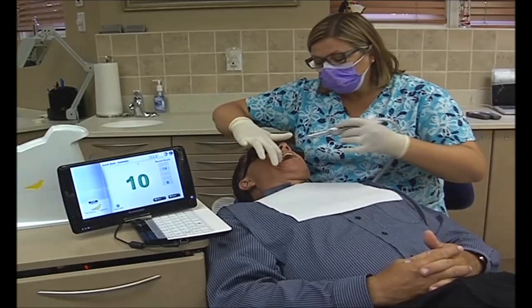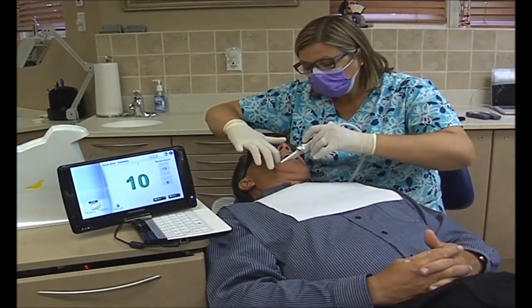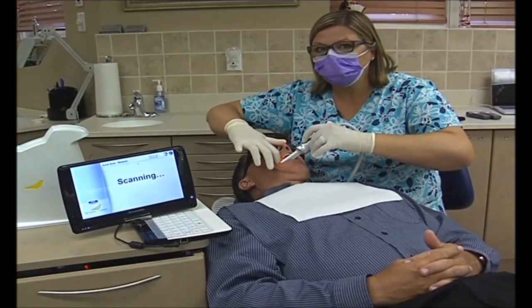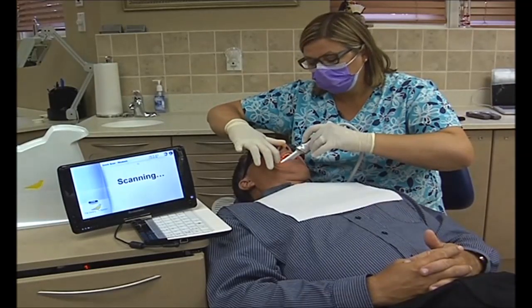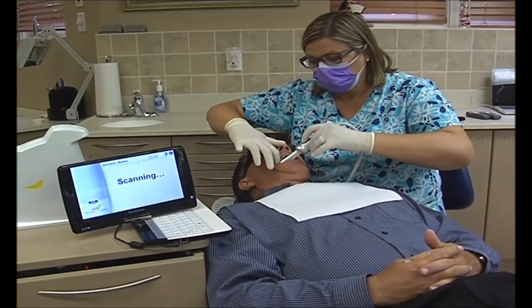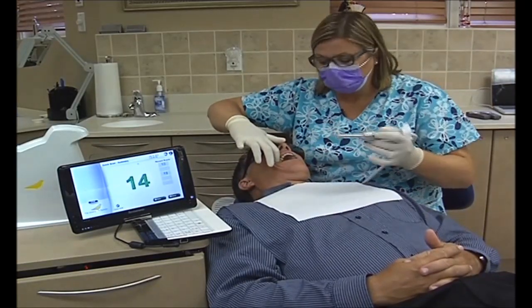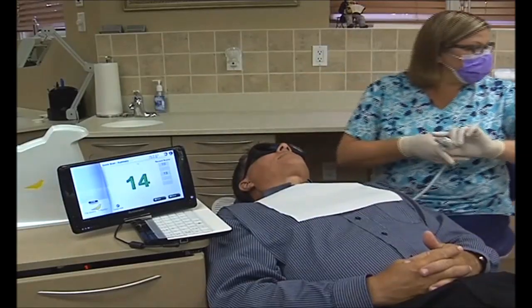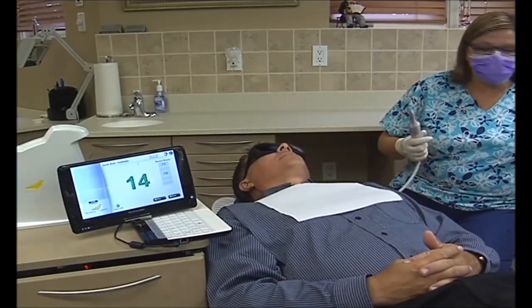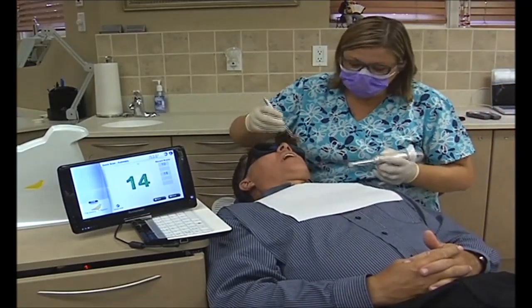The nice thing about the Canary too is I can also check interproximal. I'm doing the mesial of the 4-6. Very healthy. So now I'm going to do another tooth on the upper so that you can see how easy it is to use.